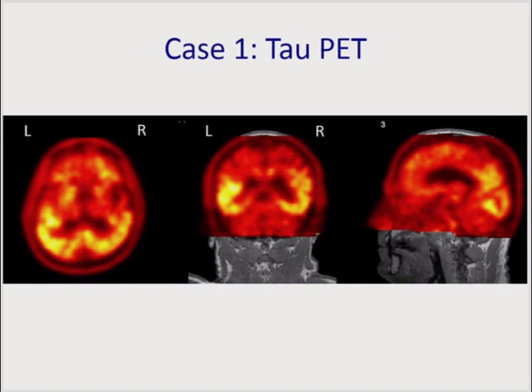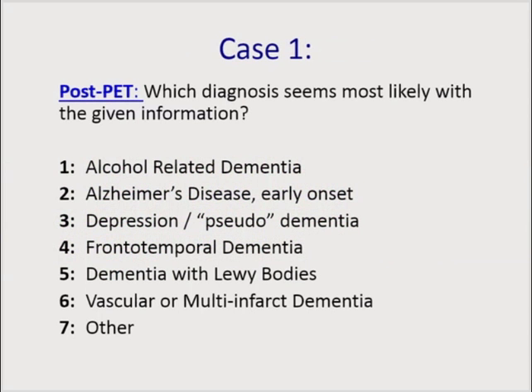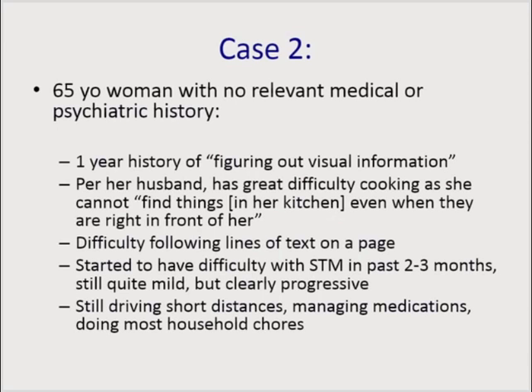Because I have it, I'll show it. This is this individual's tau PET. This is presumably labeling neurofibrillary tangle pathology. You can see that there's substantially elevated tau pathology, including along the posterior midline. So again, a work in progress, but certainly an interesting image. I think we can skip this because we already got to 100% before. And so I will go on to the next case.